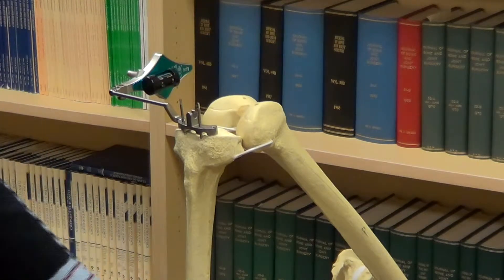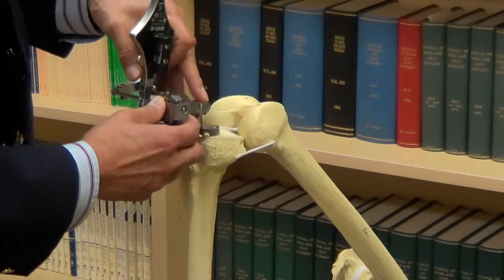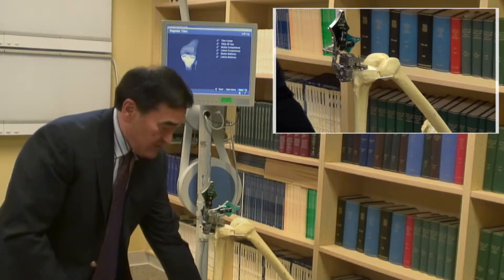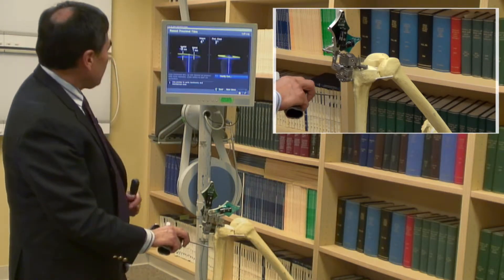From here, we attach the computer wing to adjust the bony cuts on the top of the tibia. In this model, and on the screen, we'll adjust the cuts for the tibia.